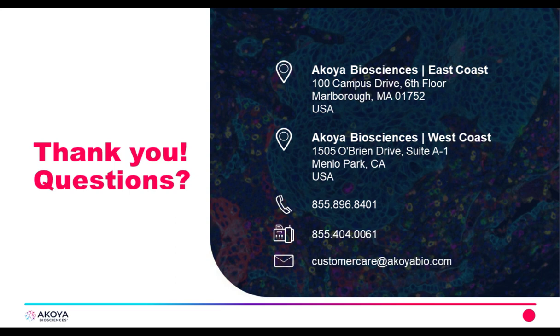Thanks, Dr. Saunders. Dr. Carlson, is CODEX compatible with TMA cores? Yeah, that's a good question. So yes, it is compatible with TMA cores, just like the rest of the tissues. You just need to section that TMA onto a cover slip.